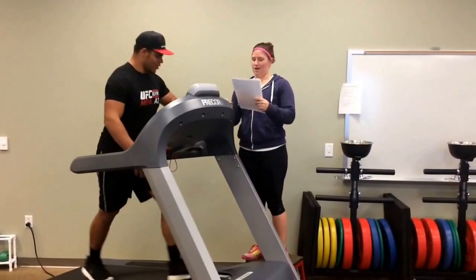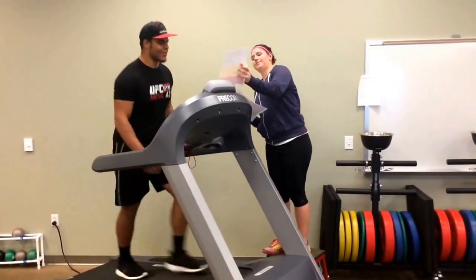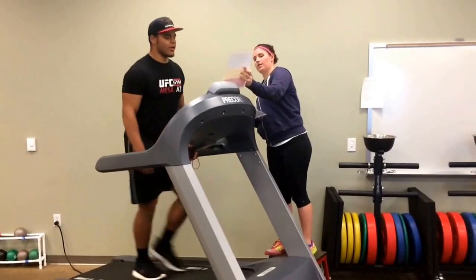Kenny, what is your heart rate? Heart rate is 116. And what is your RPE? 13 — somewhat hard.